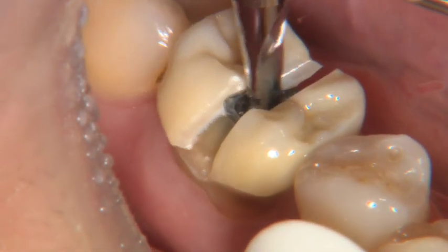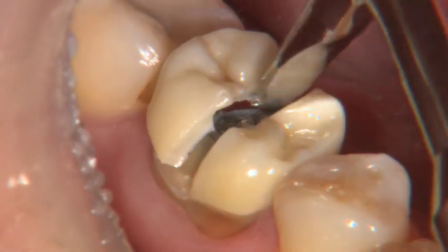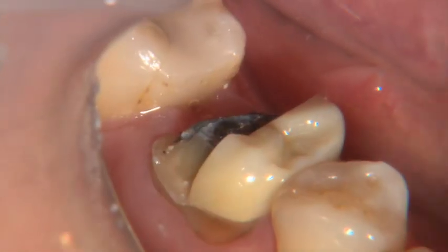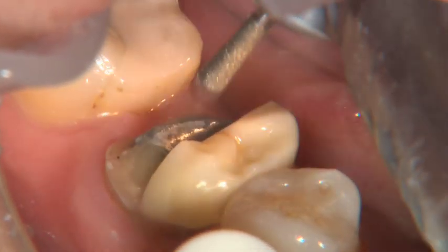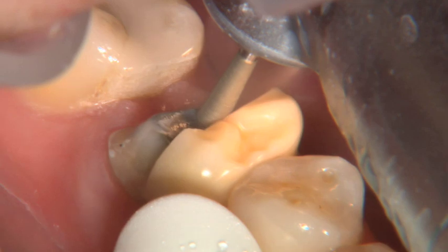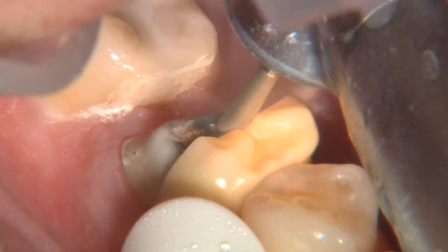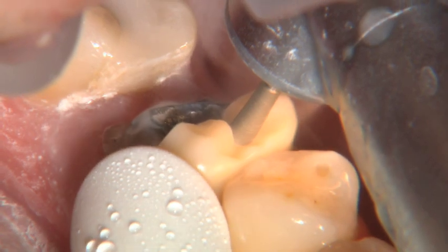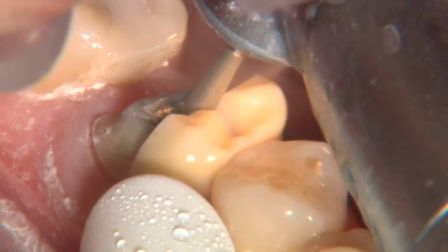You can see I'm really having to crank there, and that distal half comes popping off. And that's not only a testament to the strength of the Bruxer, but to the cement — the Relyx luting plus cement from 3M ESPE that we've used. So the whole mesial half of the crown has not even moved yet, and we've got to cut through that again because you just can't grab onto that with pliers and pull it off.